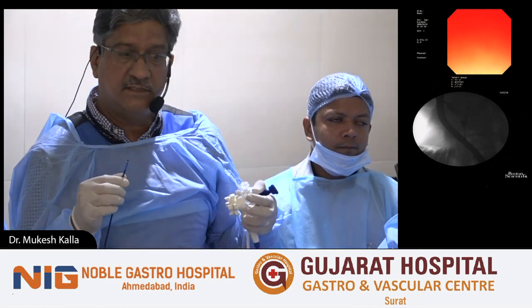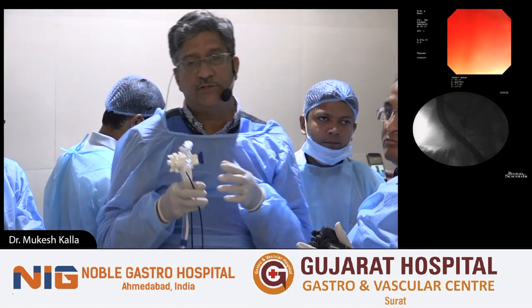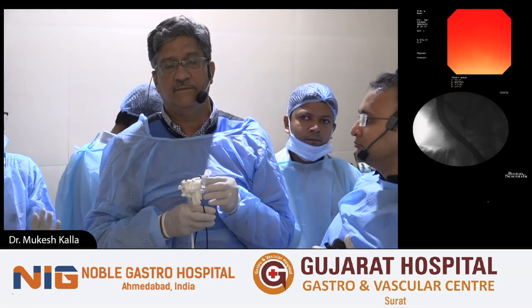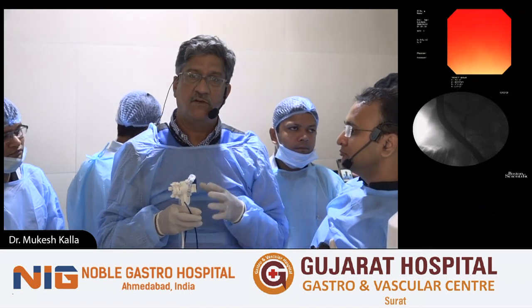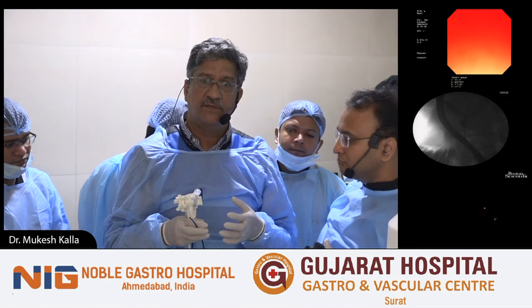So we will start. So we will change the position. Somil will help me. Another thing which I wanted to share with you, that classically in the West they call it a single operator cholangioscope. Yes, we can use it. That's not a problem at all.